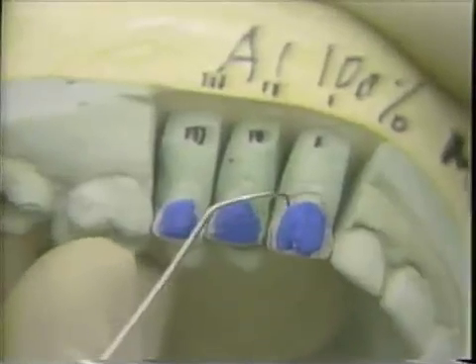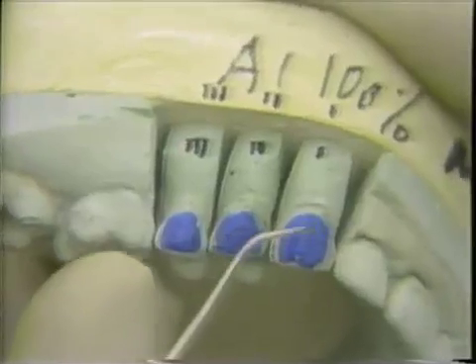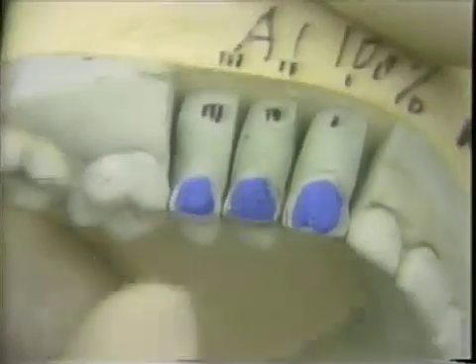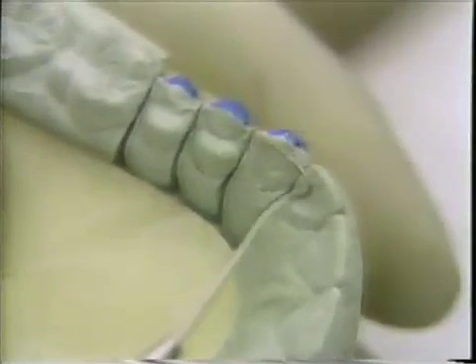You can see the details of the preparation on the stone dies. Notice the die spacer. This allows adequate thickness of cement to mask out the purple color of the teeth. If you look at this from the occlusal, you can see the details of the occlusal incisal finishing line.